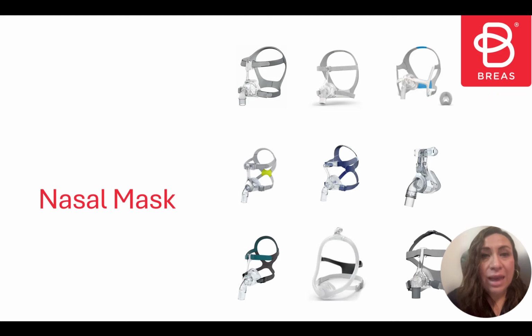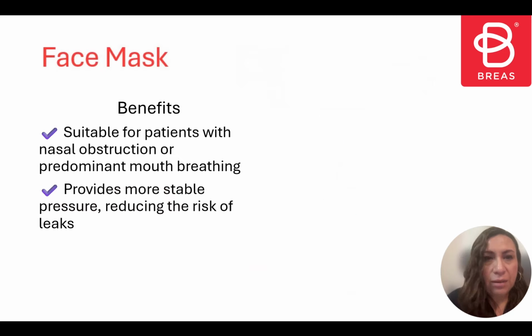We have nasal masks, masks that only take the nose, with different supports. Some have a frontal support, as seen here. No frontal support, but rather lateral support. And here we have another type of mask with a deported leak. Let's move on to the face mask.